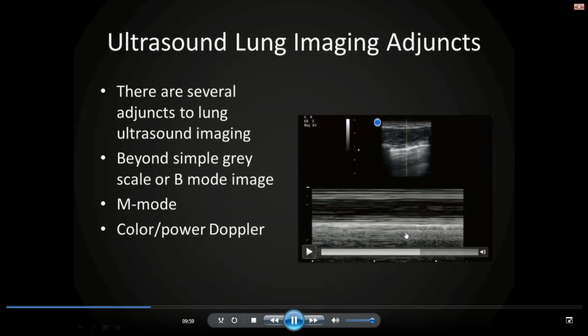And what's interesting is when there's no movement of that pleural line, you have an appearance that's similar to the top. And it's important to be wary when you see an appearance like this that goes beyond or below the pleural line consistently across the screen. And Dr. Bhagra will talk about that more.